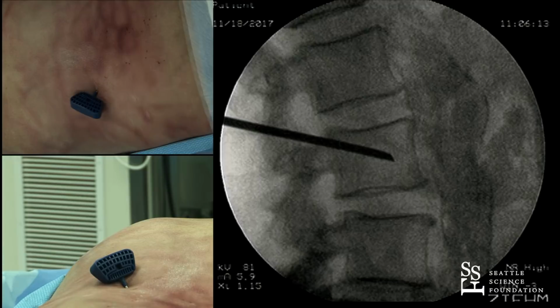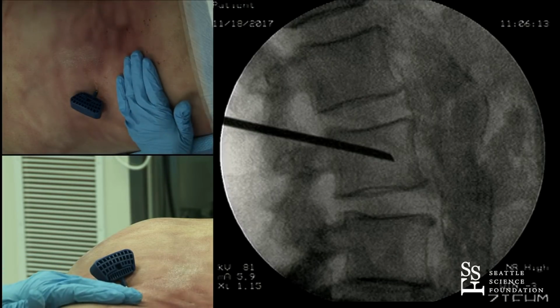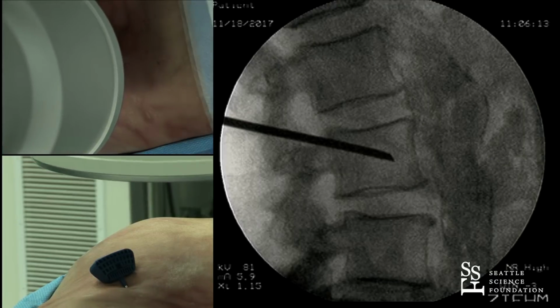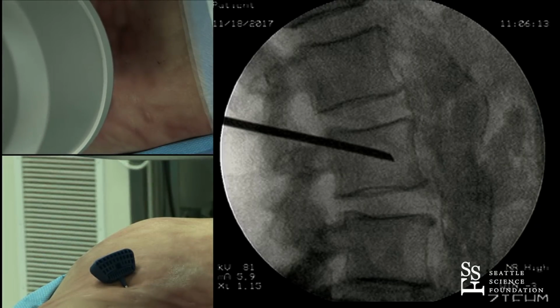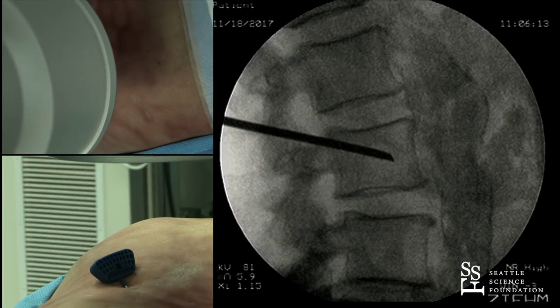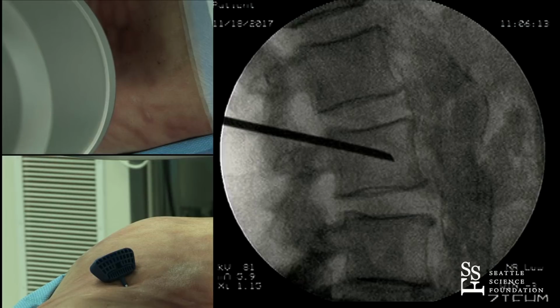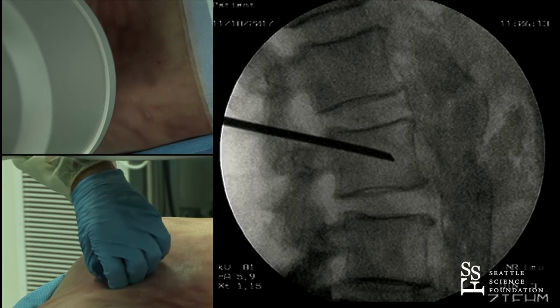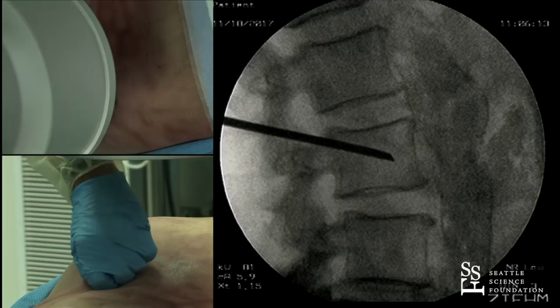So we'll come back around. And the goal is to get end-plate to end-plate fill in the center of the vertebral body to maximize your reduction. If you can do those things, you will accomplish everything you need to accomplish with a unilateral approach. If you're too far ipsilateral, or you need to maximize your reduction, and you haven't met the goals that I just stated, come back with another needle and do it on the other side.